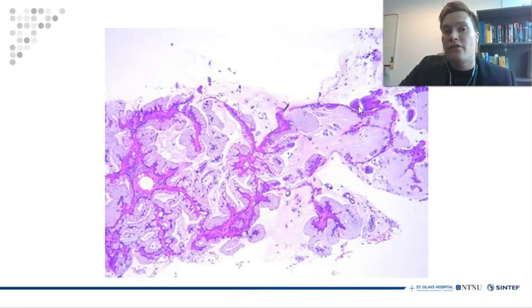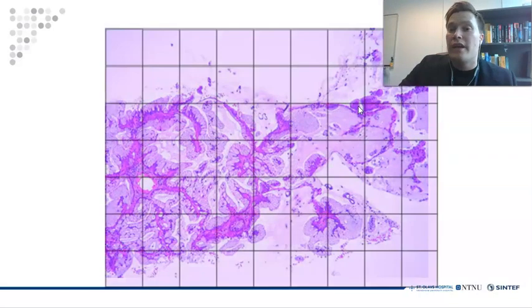Even on high-end systems, state-of-the-art CNNs can only input images of size up to 2000 squared pixels. Thus, the image we chose to use is too large to be used with the CNNs. However, downsampling further might result in too much information lost to solve the task at hand. Thus, the most common solution is to tile the image, that is, to subdivide the image into smaller regions and stream each tile individually through a network or algorithm and stitch the result.